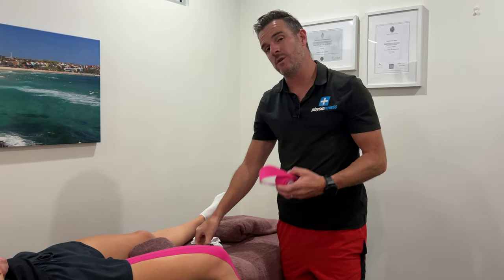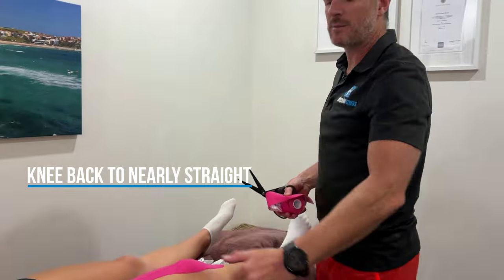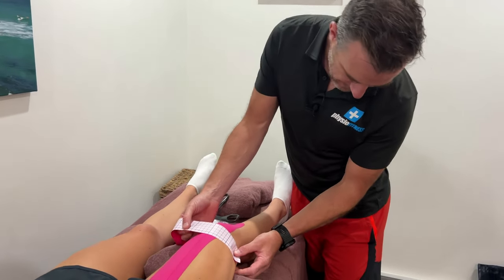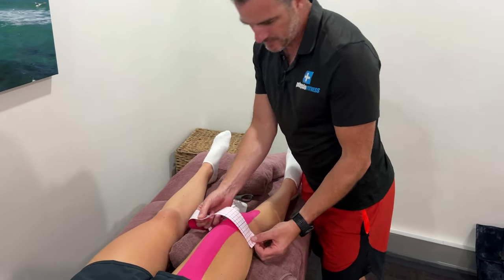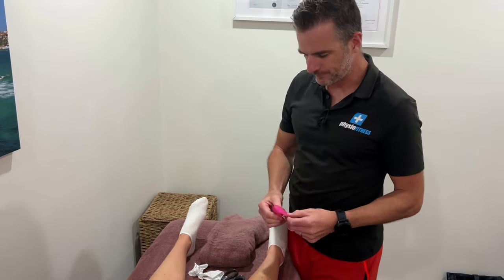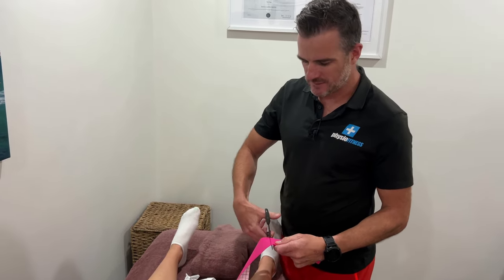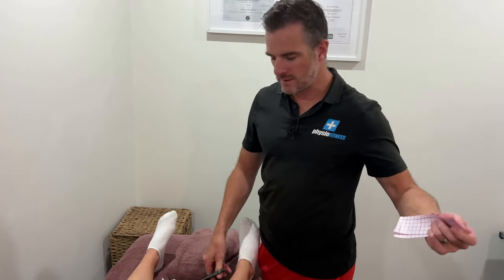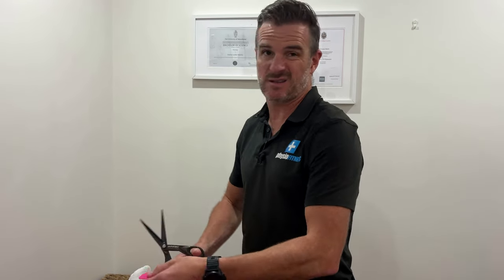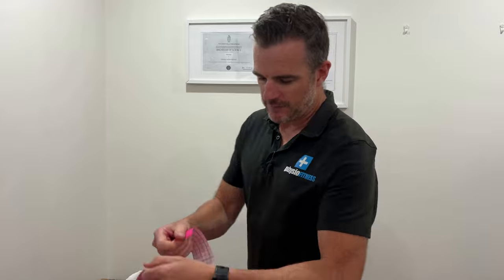The next tape determines whether you're doing quadriceps or patella. Bring them back into a flatter position because we're not dealing with a long tape anymore — we're going to go across. For quadriceps, you measure from side to side — about four squares. It doesn't matter if you overshoot a little because the anchors can just wrap around the back of the knee. I would do one or two of these depending on how weak they are. I've got a patient at the moment who actually has a tear in the quadriceps tendon — an old tendinopathy with a tear on top — and he needs a double layer to really help. Those really weak ones, you might find one is just not enough.